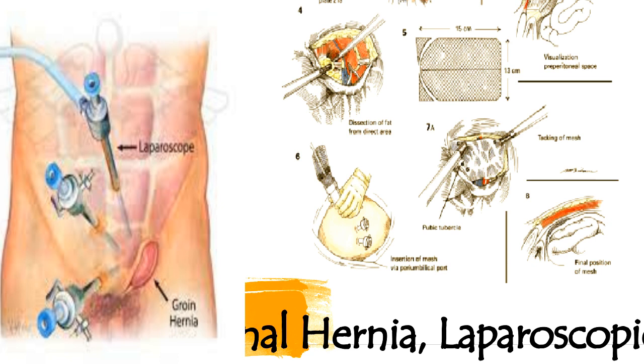If this becomes problematic, a Veress needle or 5 mm trocar can be placed in the peritoneal cavity to release the CO2 pressure. The spermatic cord is then skeletonized and the preperitoneal space dissected to the same extent as the TAP. Although the orientation is different, the dissection and the mesh placement are similar to the TAP.